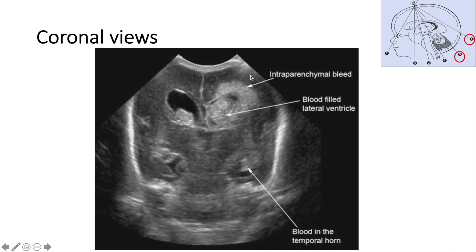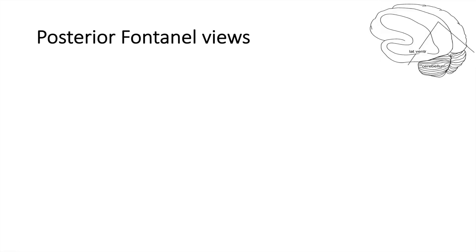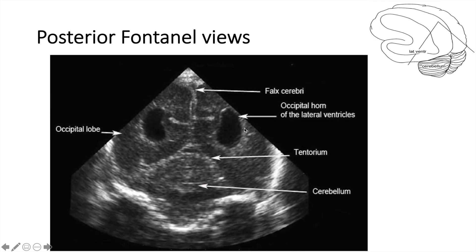This is more intense and represents grade four IVH — you can see there is extension into the brain parenchyma. Then this is a posterior cut of the brain, looking at the occipital lobe.